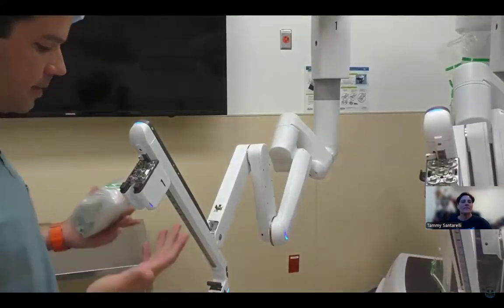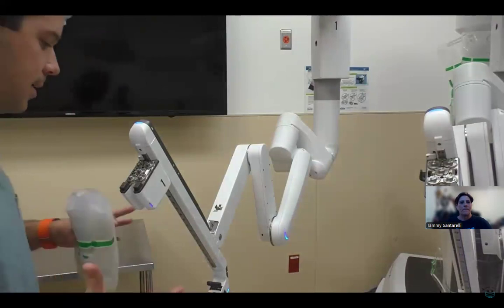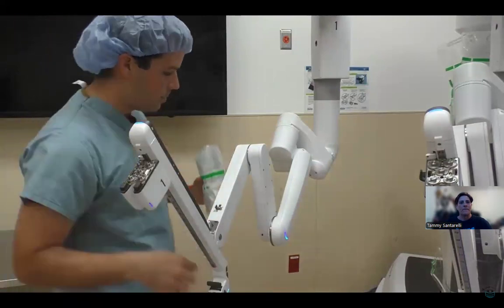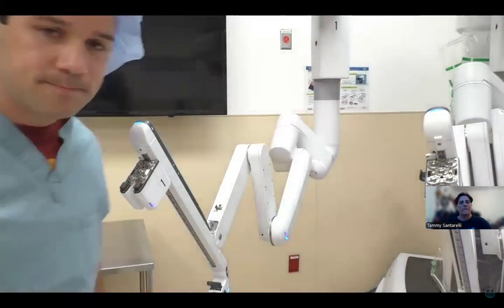Our arm drape, it's much easier on this console, or on this robot, than it was on the SI. You're basically going to start over this arm and move up, move up, move up, move up, move up, until you get to the magnets, and just put the magnets in place.